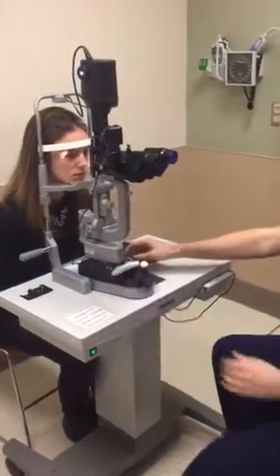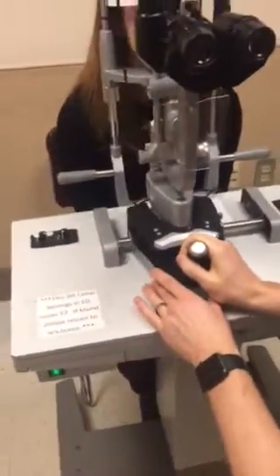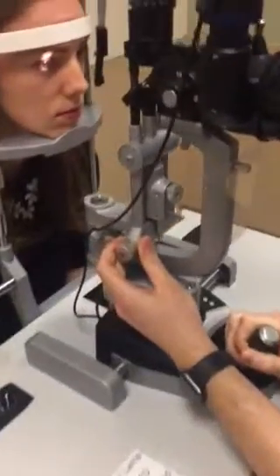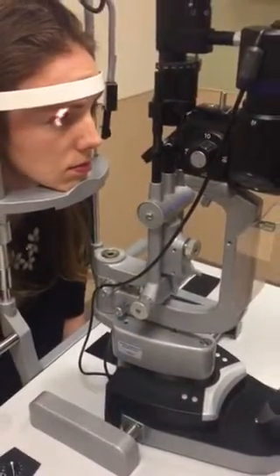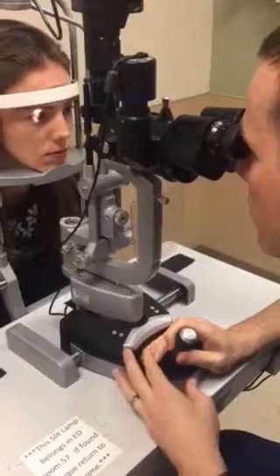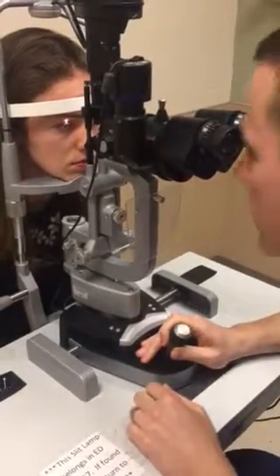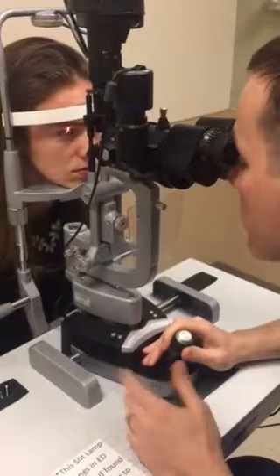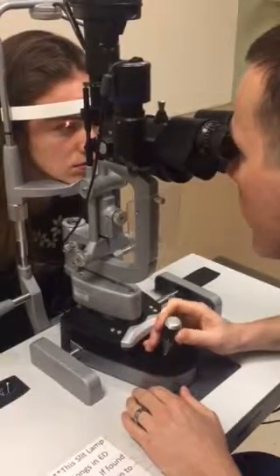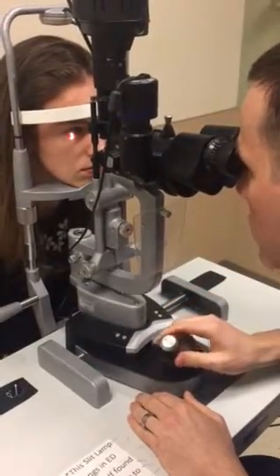To start your slit lamp exam, unlock the locking screw — now the microscope itself can move freely on the base of the table. With the joystick or control lever all the way back, look through the microscope and move it forward until the eye comes into focus. The light is in focus — that's essentially gross focus. Then I can use the joystick to get better fine focus. Moving the control lever clockwise moves the light up; moving it down moves it down. You can also move it left or right.